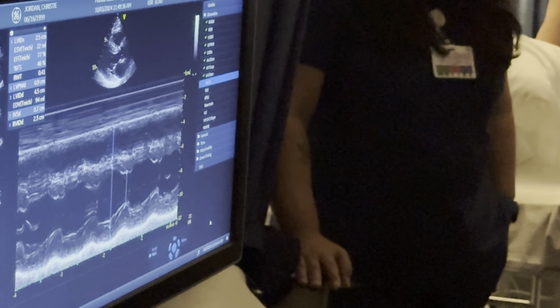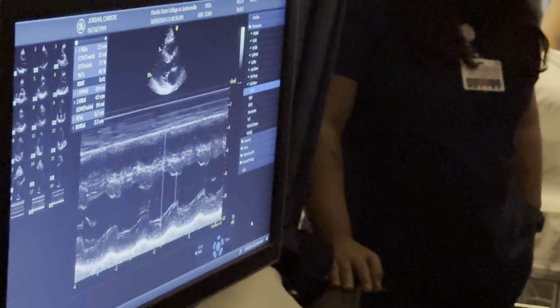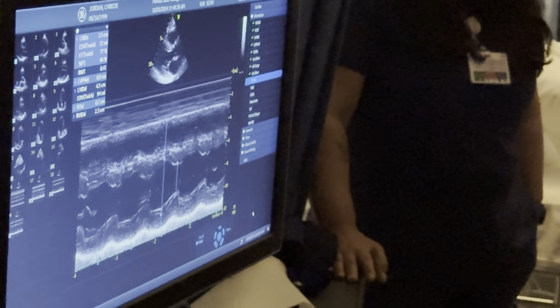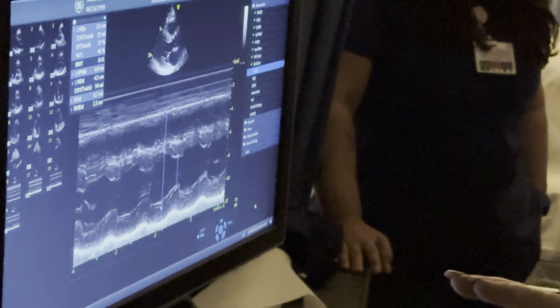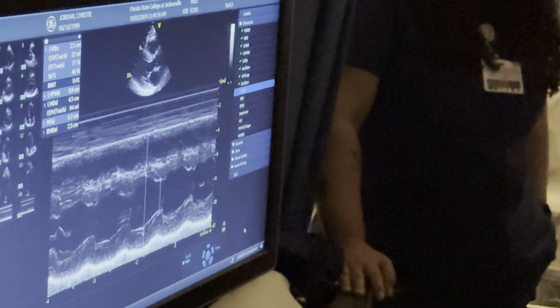So we make sure we took a picture of that. If you're not sure, then take another one. But when I hit store, I always watch for it to pop up here, okay? So if you'll look, see how it pops up there? My eyes are kind of going back and forth and watching it pop up there, right?